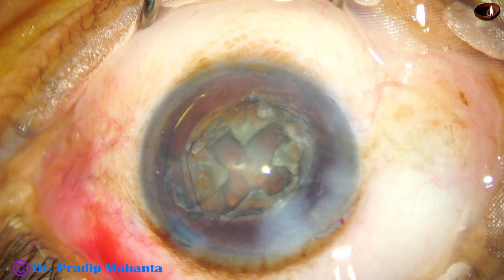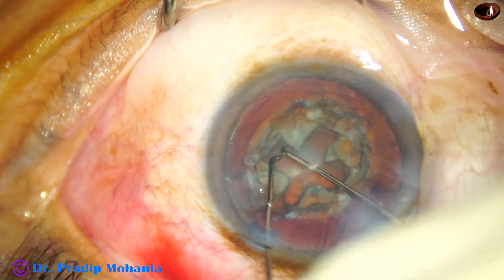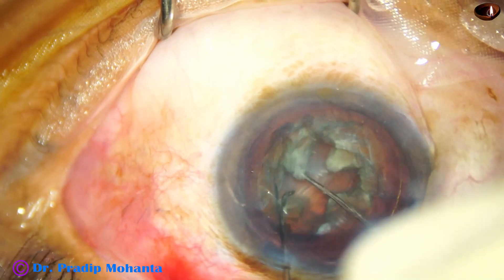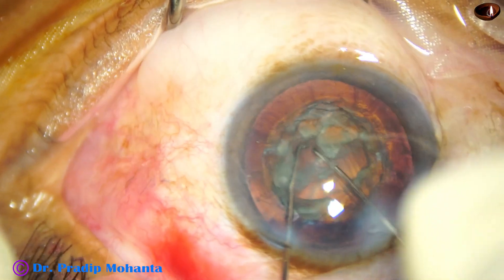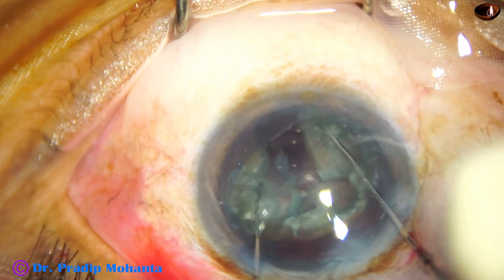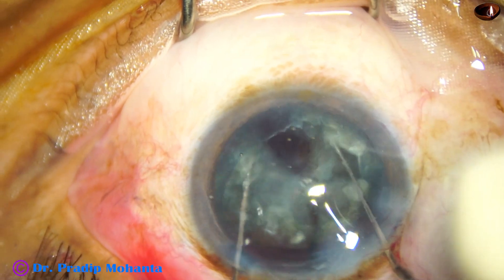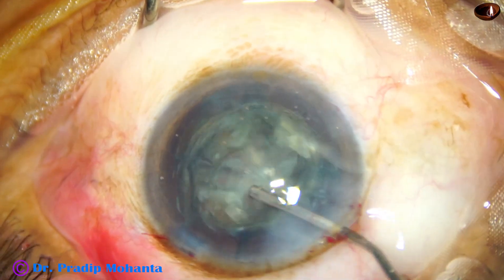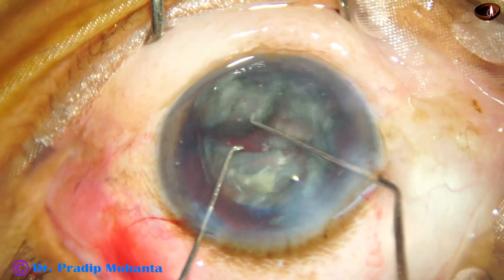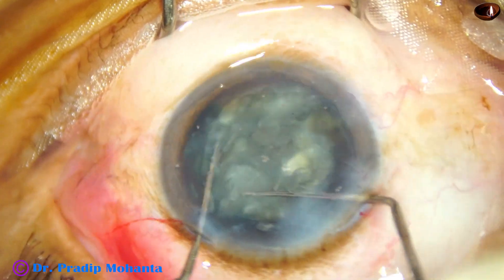You may find it cumbersome initially, so you can take two hooks, go to the floor of the trench, and apply opposite forces. If it doesn't crack, try the other side — yes, you can get a crack. Try again here, and this time it cracked. Go to the floor of the trench and apply opposite forces. If you can't crack, you have to sculpt a little more and then it will crack.